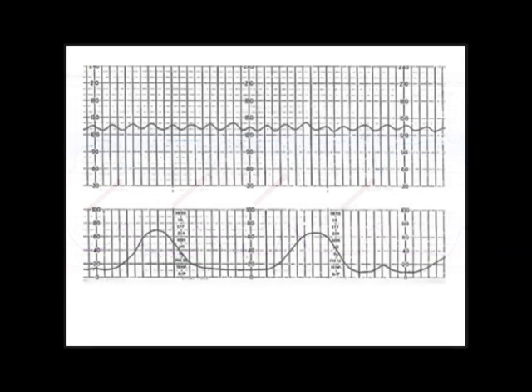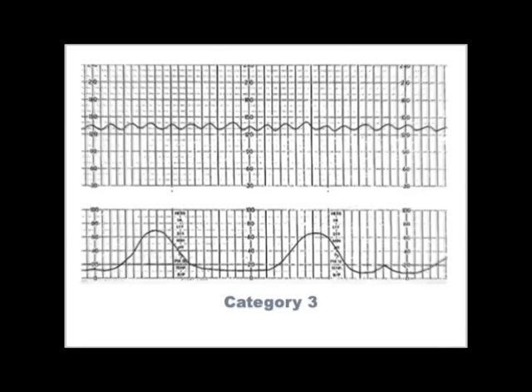This next fetal heart tracing is what category? Yep, it's category 3, which is a very hard category to meet, and there are strict definitions for it.